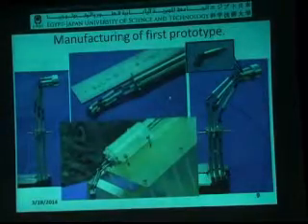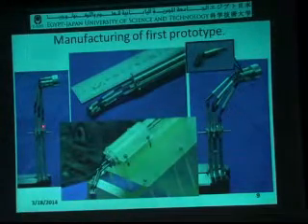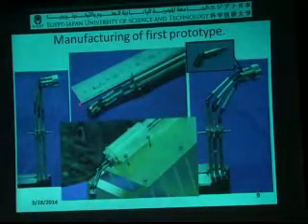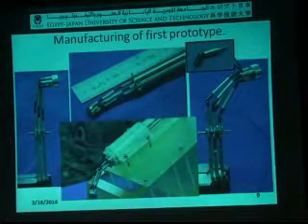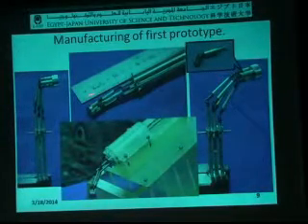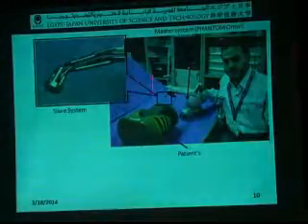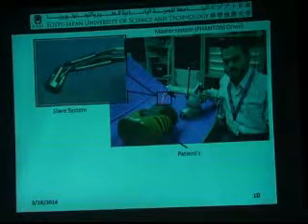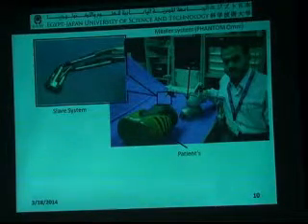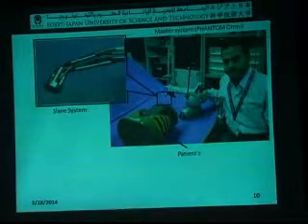Okay. And here is the end product of the manipulator. You can see here, this manipulator can bend to an angle like 90 degrees. The manipulator is very small. This size is 1 centimeter to be able to go through the minimally invasive work. The length is about 5 centimeters here, but maybe it can extend to 11 centimeters. And here is our student Khalid, and here is the robot, and here is the master unit. You can operate this robot by any kind of joystick, a very cheap kind of joystick.